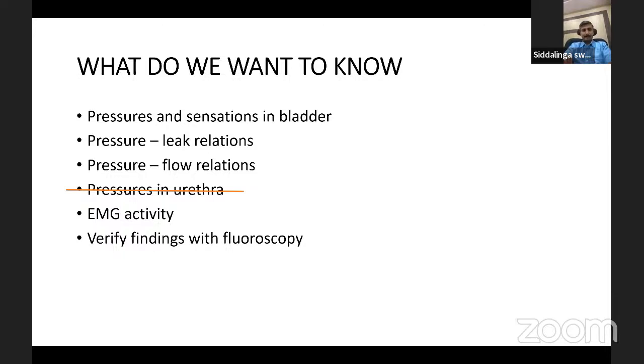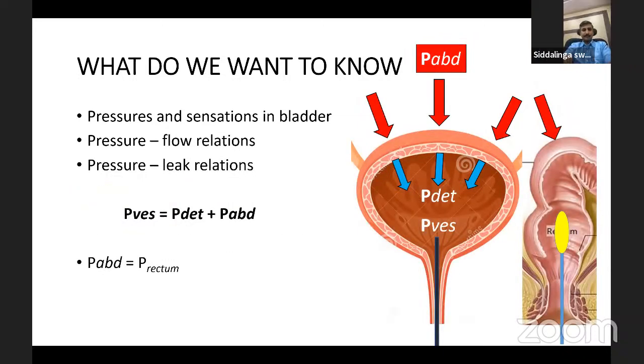EMG activity, I'll just give in passing because it is generally, in my experience, not a very useful study because it is very difficult to maintain and interpret EMG. But if you can do it properly and afford the fragility of EMG probes and all, then it can be a good supplement.